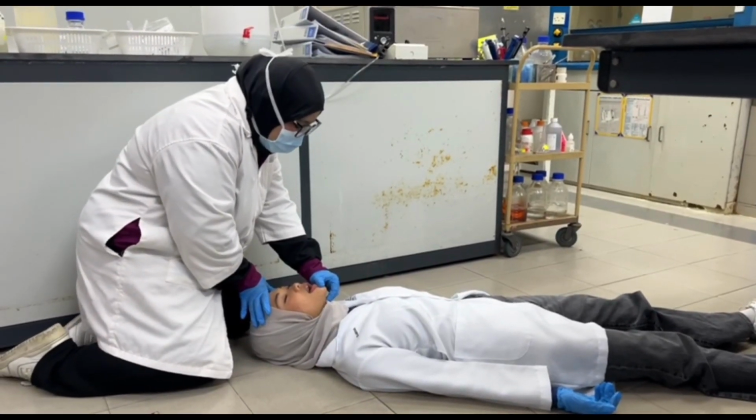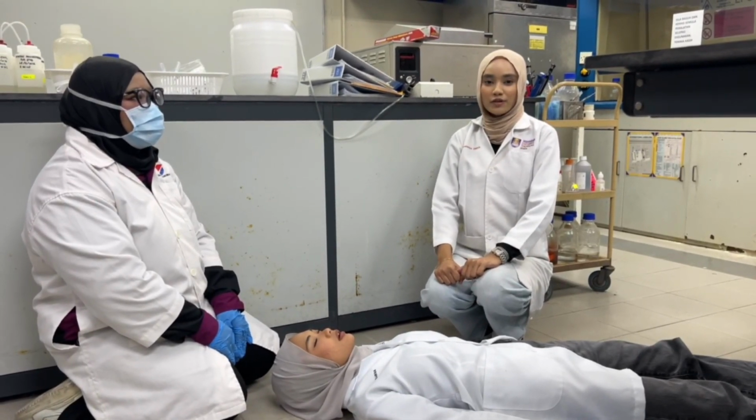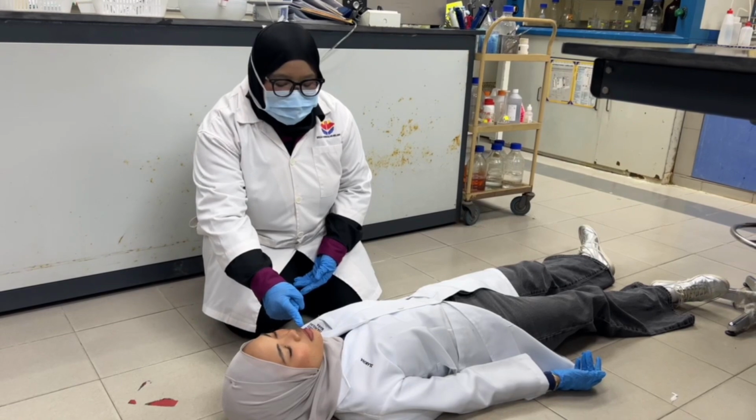The airway appears clear. The airway must be opened using the head tilt chin lift technique while checking for visible obstructions. I'm checking for breathing.